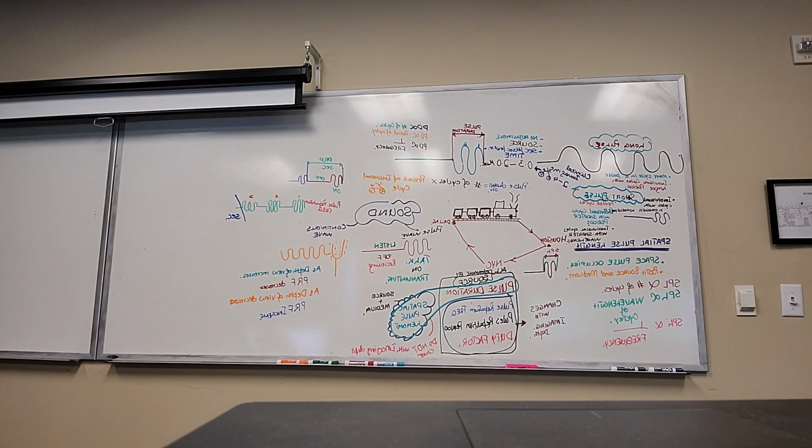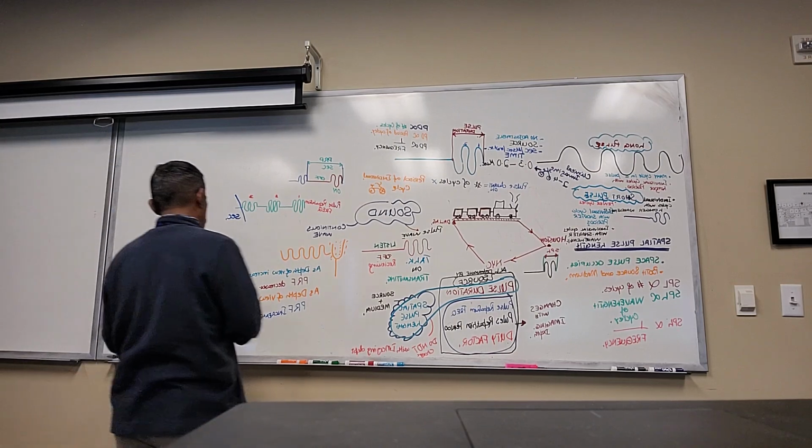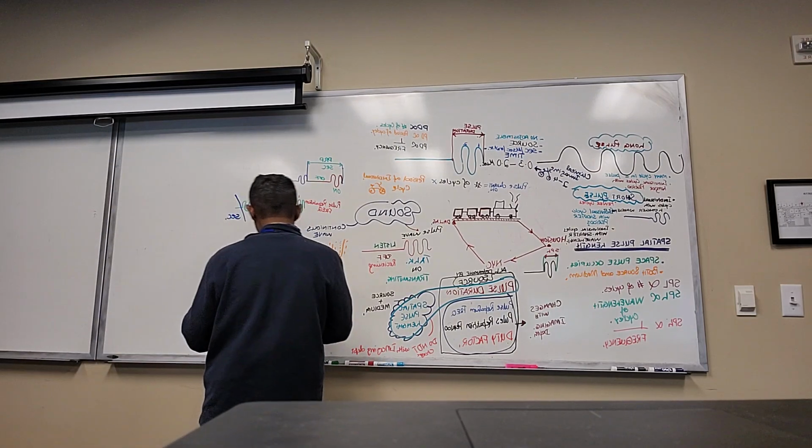When the system is imaging shallow, PRF is higher. When the system is imaging deep, PRF is lower.